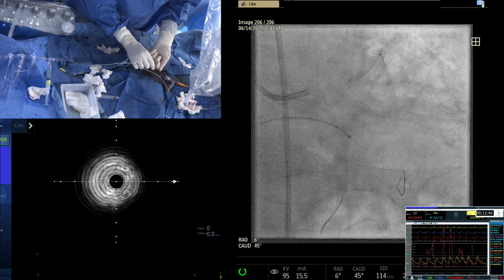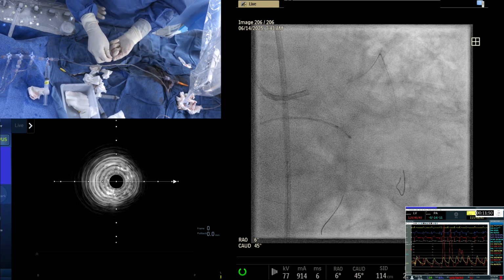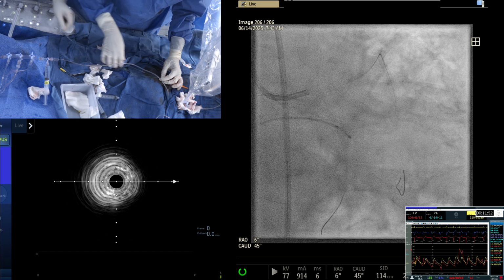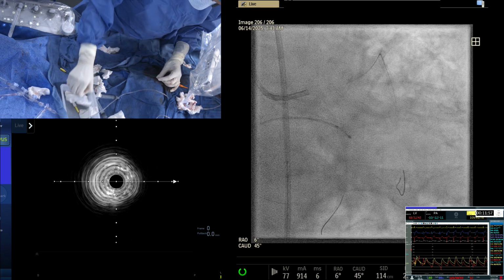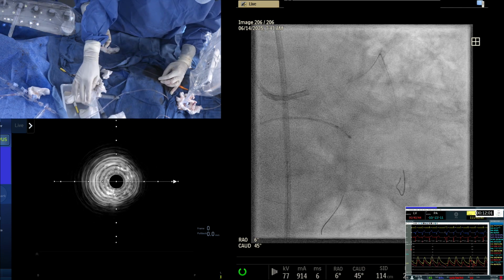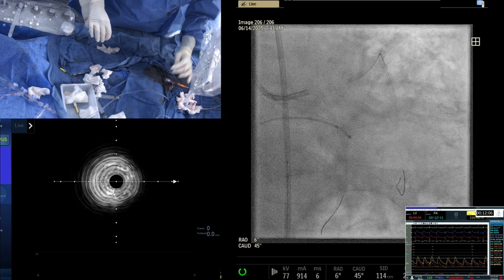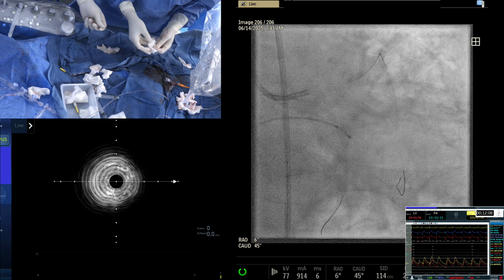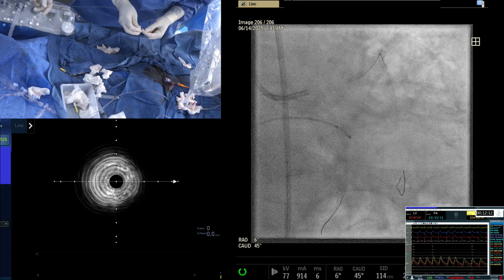Now, let me ask our panel, all the expert imaging guys or girls who are there: what will be your cutoff of the lumen area, MLA, for the circ not to do anything? We know it will be down. The question is what we will be happy with. If it is more than 4 millimeters... Oh no, it will be less than that, my friend. I'm talking about can you settle for 2.5 or 3.0? That's the question. Ideally, you're right, 4 is the cutoff.